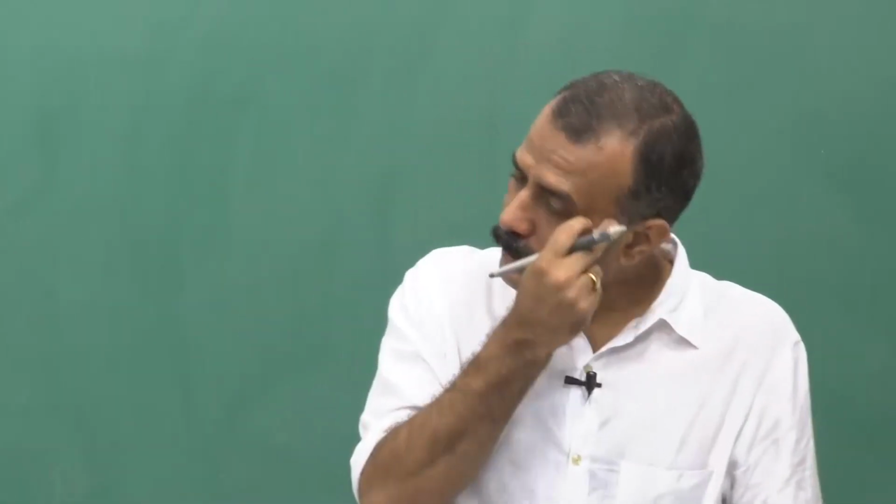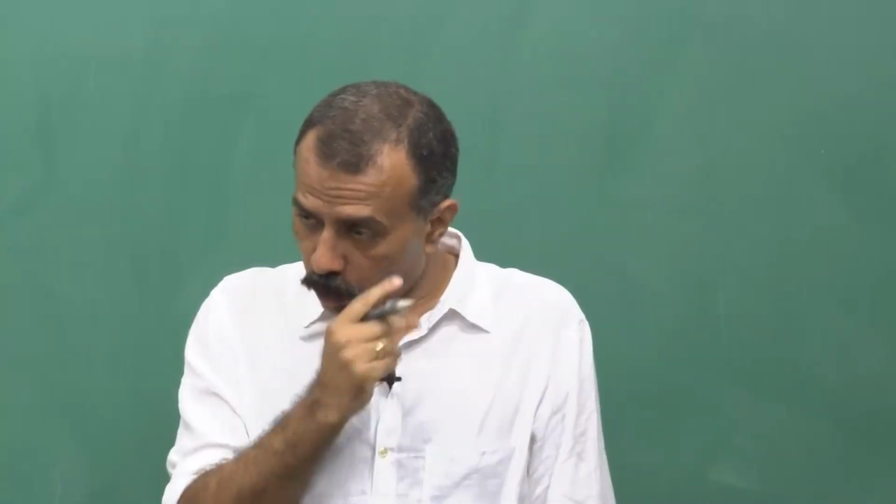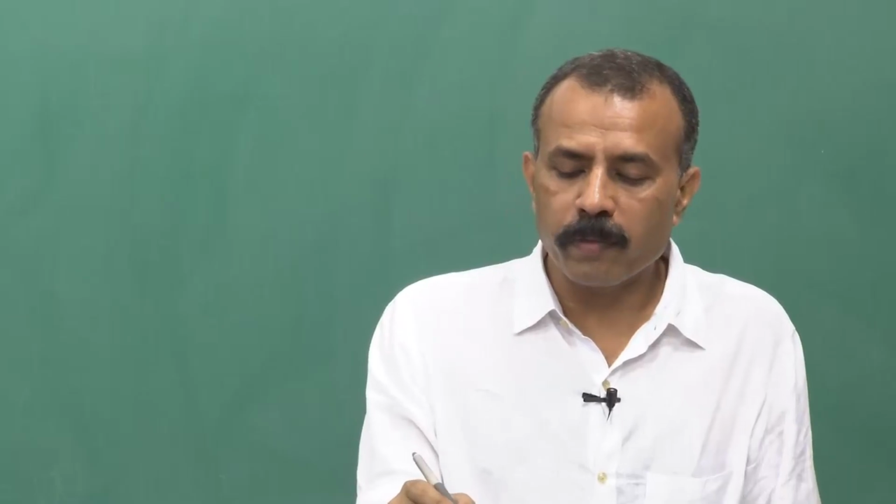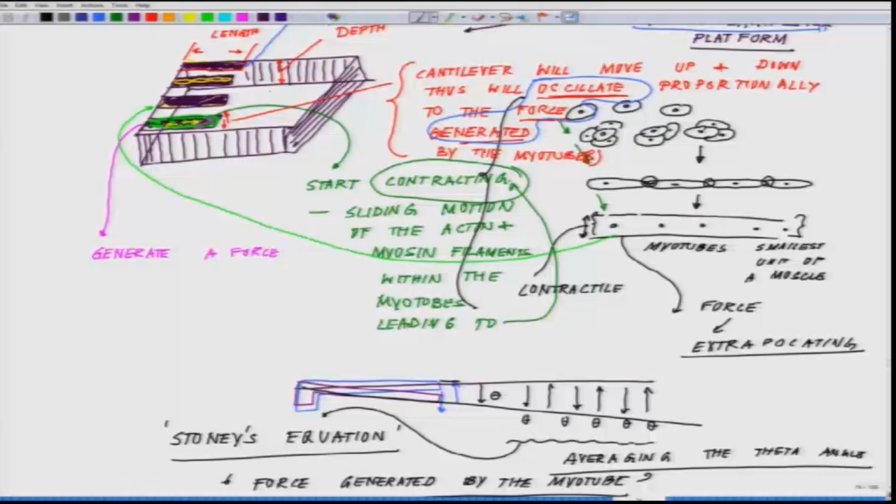Now, having said this, this is not such an easy technology. You have to realize that while you make a well like this, there is a very limited amount of medium which can be placed there, and that needs a lot of optimization, a lot of process.